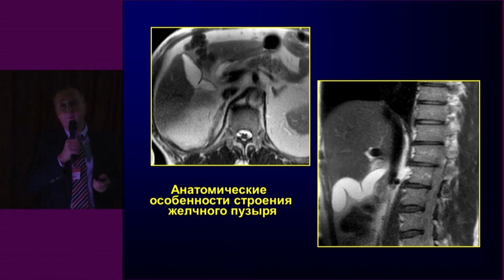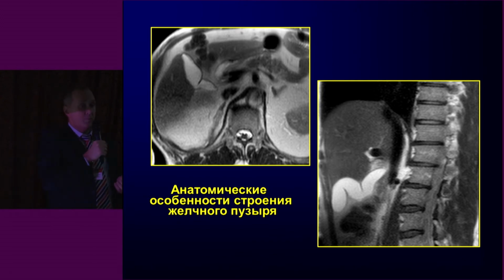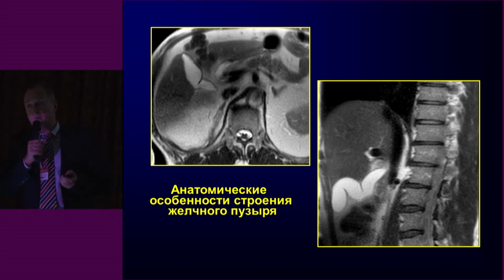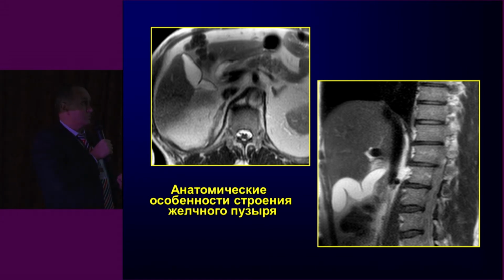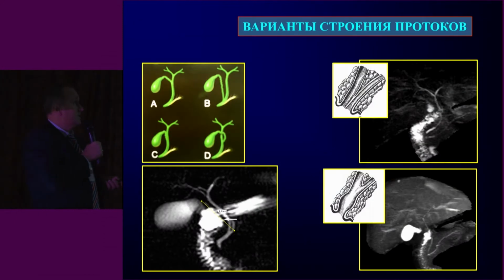And with the biliary system, panoramic scanning with ultrasound will not provide you with such a panoramic view. But you know that such a gallbladder should produce symptoms, even more severe, as in the case of colic. In this image, we could obtain it in 4 seconds.